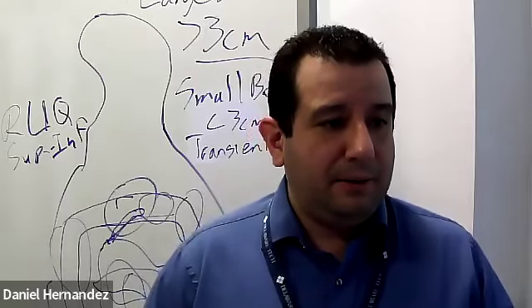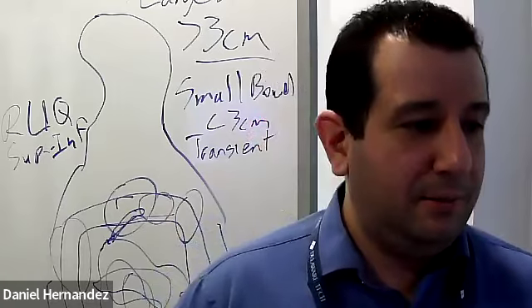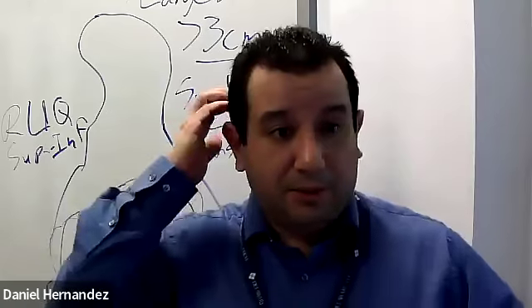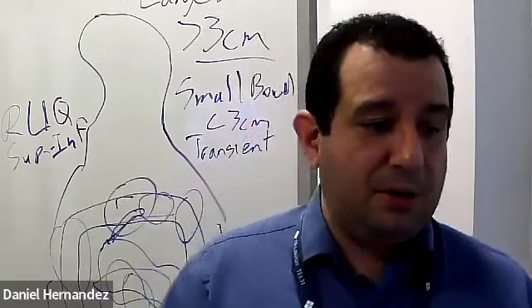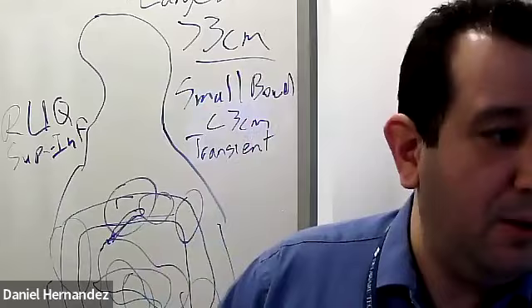Followed by focusing on the bowel, use a high frequency linear transducer. The bowel is followed starting in the right lower quadrant as we move throughout the quadrants.